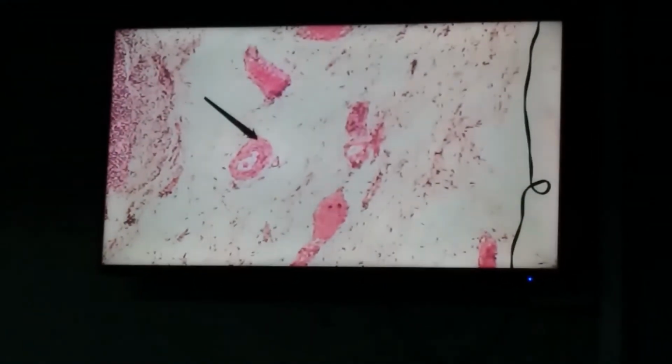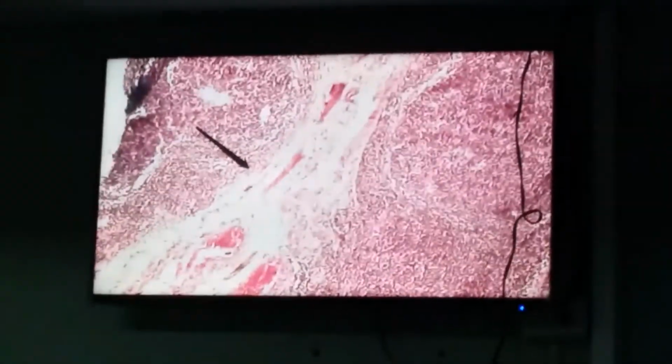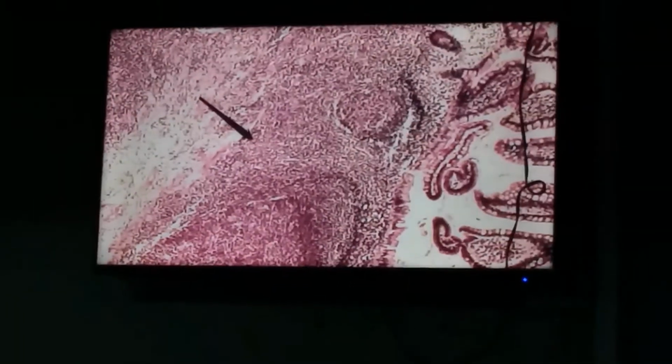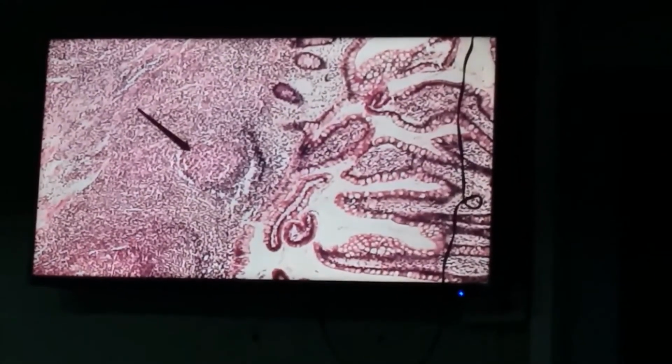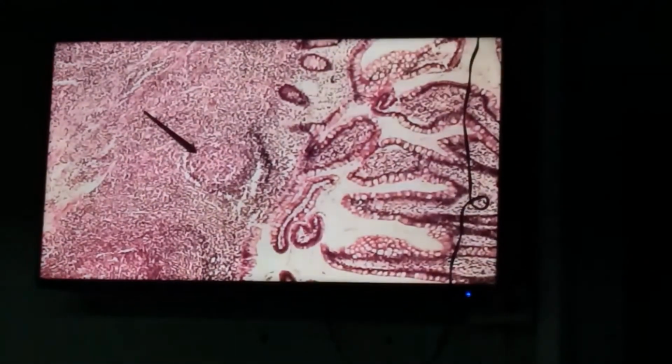Okay, this is the second type of muscle in this organ in focus. This is actually a familiar slide. What slide is this? Very good. You can take the exam already. So this is your ileum because of the presence of Peyer's patch. So this is the Peyer's patch.